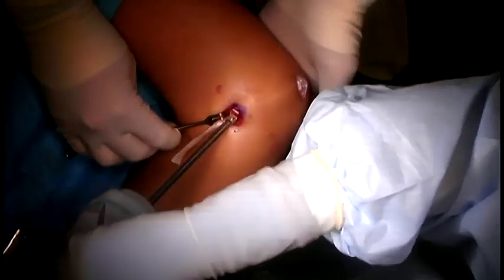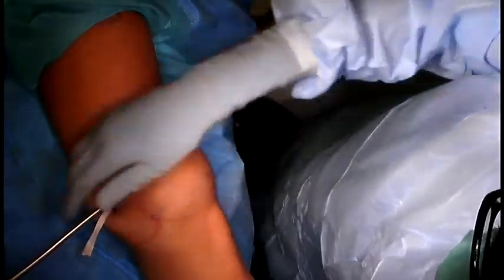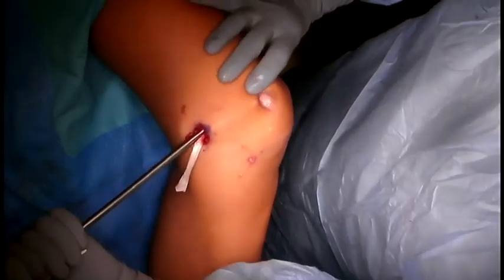In this case, an expanding anchor is utilized, which allows the graft function to be assessed prior to final fixation. This includes 2 quadrants of translation of the patella in extension, less than 1/4 quadrant around 30 degrees of knee flexion, and slackening of the graft in deep flexion.